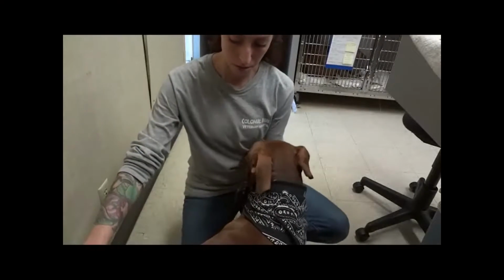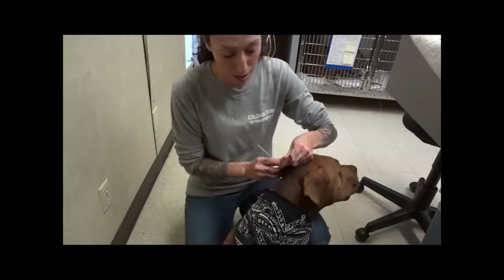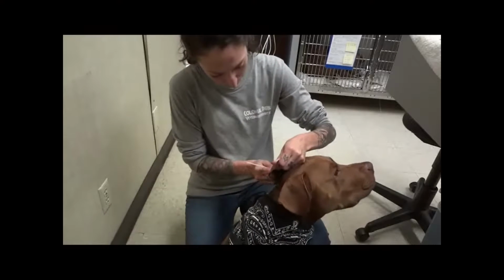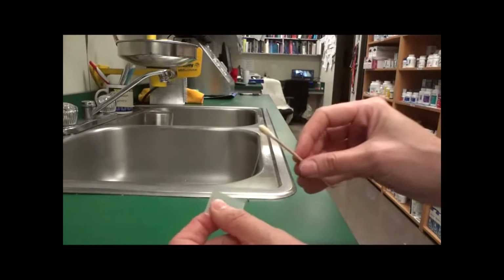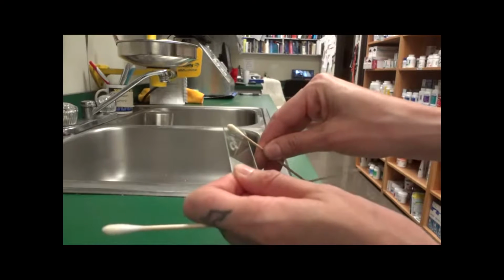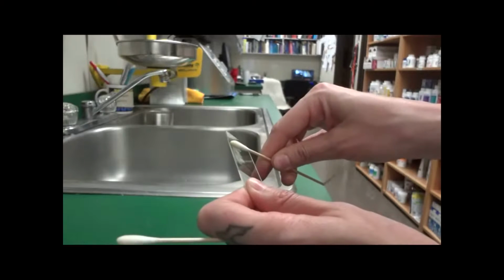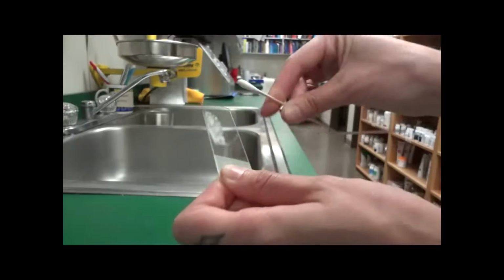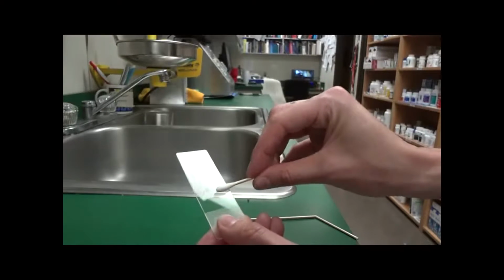Sit. Making sure that we get a good sample from the ear canal itself without going too deep to hurt the eardrum. Apply them onto a microscope slide, being sure to roll the sample and not smudge it. Got the right ear on the top, and then the left ear on the bottom.